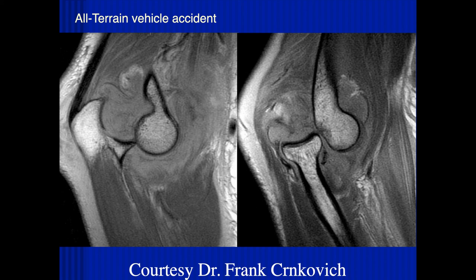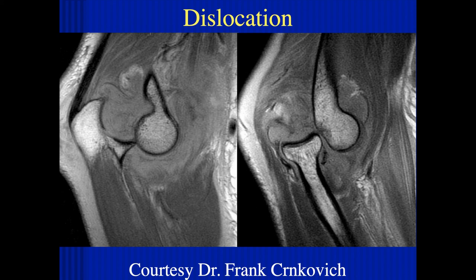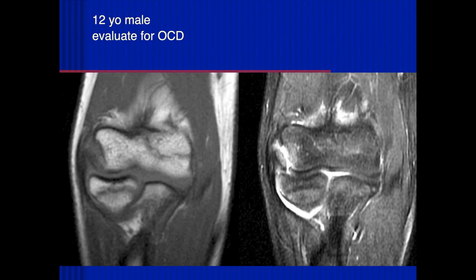This is an elbow dislocation scanned in the scanner — the radius is not articulating with the capitellum anymore, so it's dislocated. A 12-year-old male: there's an avulsion fracture of the lateral epicondyle at the attachment of the common extensor tendon and a joint effusion. This is actually a bony avulsion, getting posteriorly toward the lateral ulnar collateral ligament — a bony avulsion of the lateral ulnar collateral ligament.